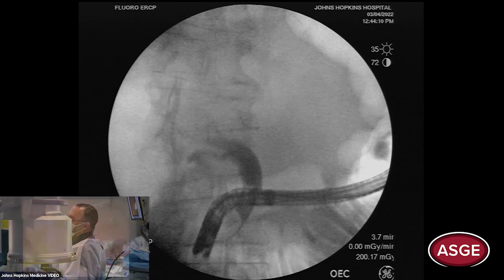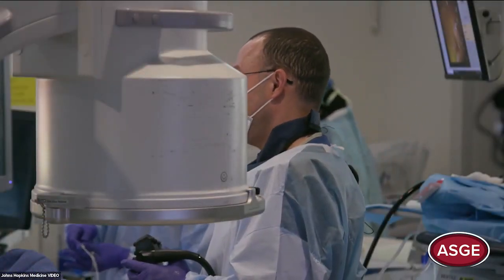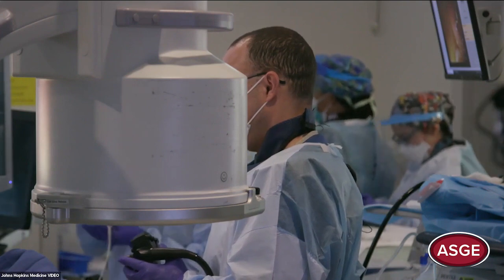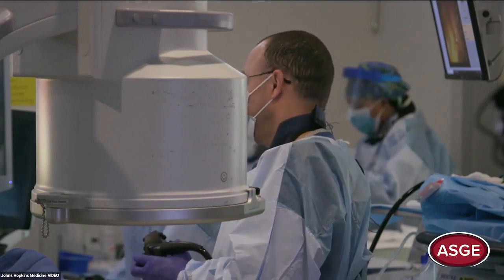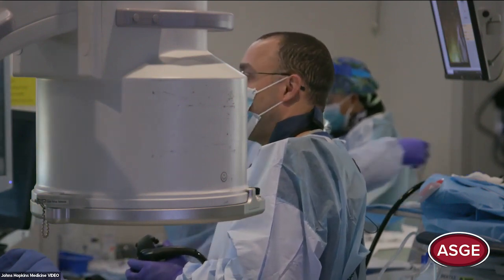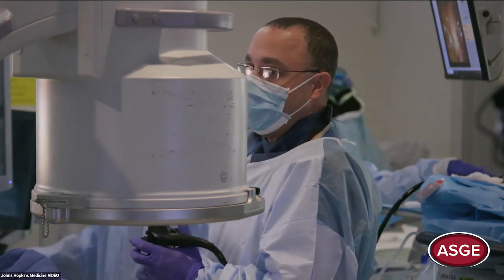Audience/discussion: what do you think about just establishing drainage in a patient with cholangitis rather than trying to do a lot? I agree — just like we said, you have to come back later anyway to take the stent out. Drainage is the most important thing, especially if the patient is unstable. It's better to drain and come back to fight another day. The distal duct as it entered appeared narrowed — I think that's all stone there, given this is a 1.3cm stone.